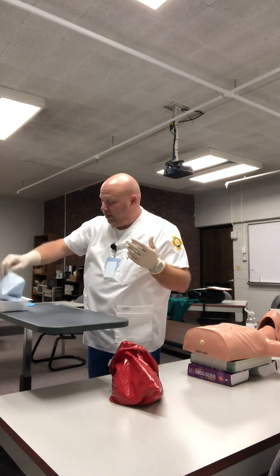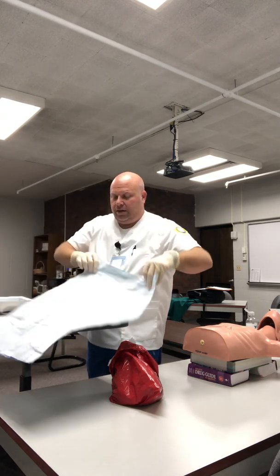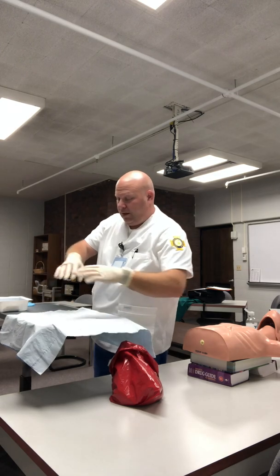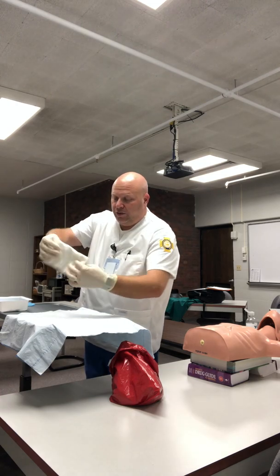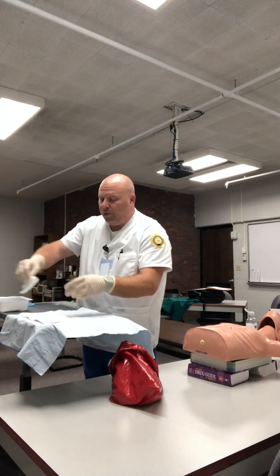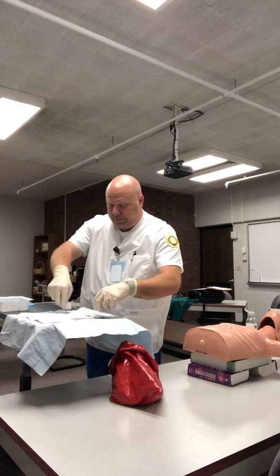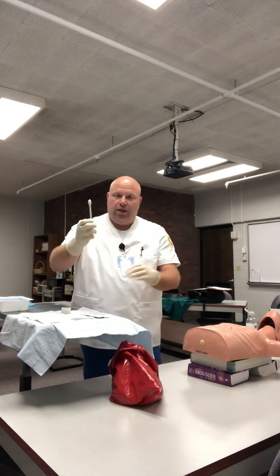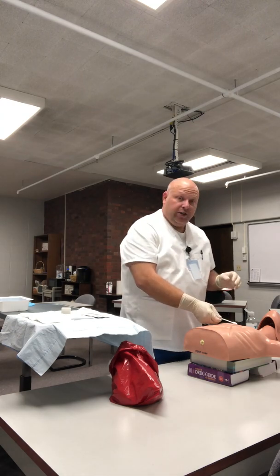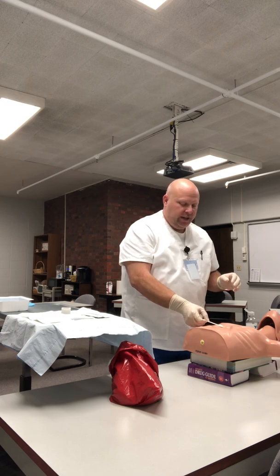I'm going to reach in and get my sterile dressing drape. This is my sterile field. I'm going to lay all of my material out here that I'm going to need: my ABD pad, my 4x4, the antiseptic wipes, and my tape. First, I'm going to take one antiseptic wipe and go down the center, least contamination to the most. So we're going down the center, rotating, cleaning each staple and suture as we go down.